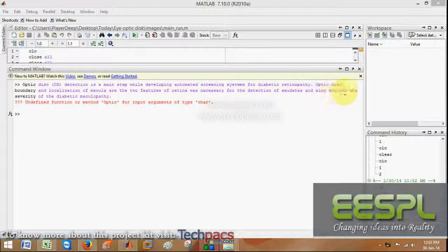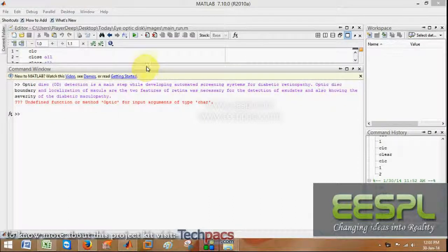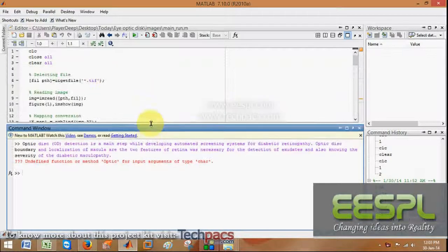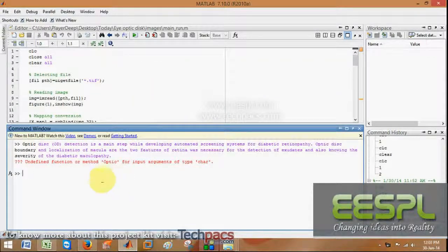Optic disc boundaries and localization of macula are the two features of the retina necessary for the detection of exudates and also knowing the severity of diabetic retinopathy. So let's have a look at how it will work.